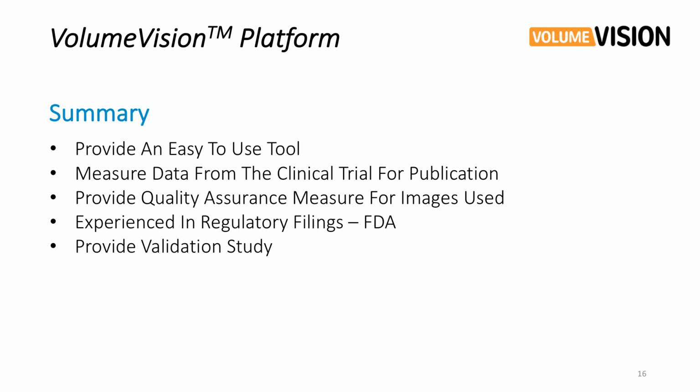We're experienced in doing this. We've previously filed an FDA clearance which has been approved, which we will do again in this project. And we will also provide a validation study which will prove that the data that you're seeing in the reconstructed images mathematically matches what would be happening if this was traced manually by clinicians. And this will further give comfort that the results will be useful and will be accepted for publication.